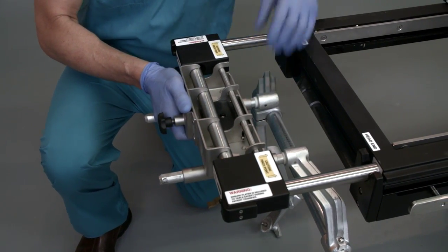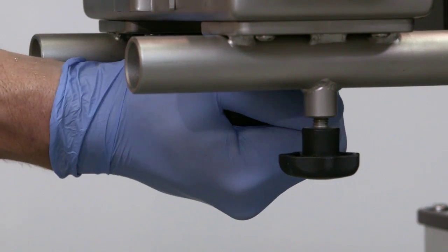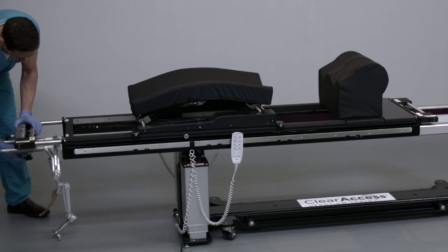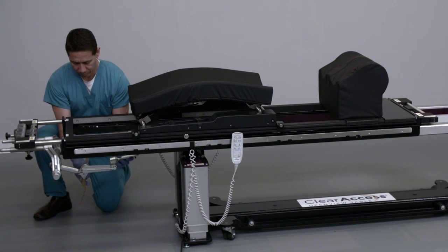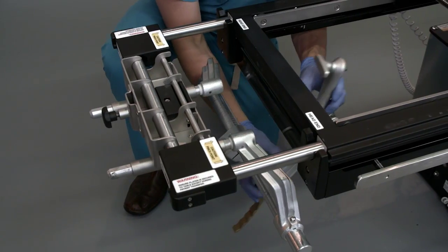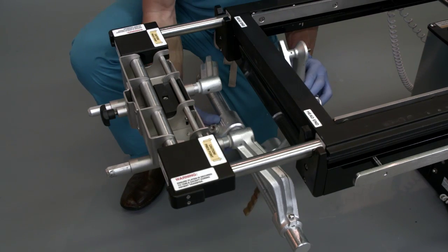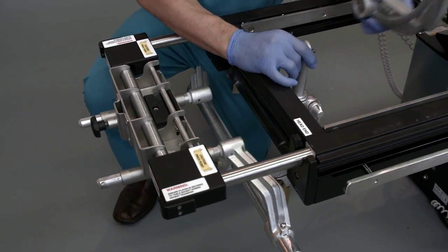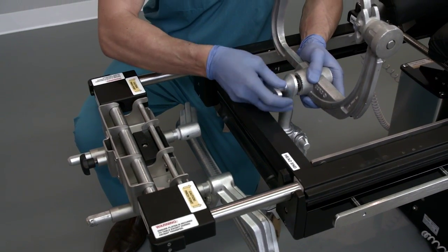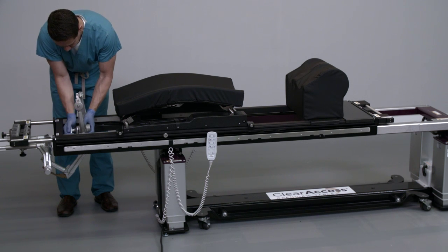Lock the adapter and base unit to the handle by firmly hand tightening the locking knob on the bottom of the adapter. Verify that the system is firmly locked by pulling on the components to ensure no movement. Once the adapter and base unit have been installed correctly onto the Clear Access table, the base unit and skull clamp should be utilized in accordance with the instructions for use of those systems. Most base units will accommodate a variety of skull clamp locations. For illustrative purposes, observe how the skull clamp is joined to the base unit and ultimately locked into place.